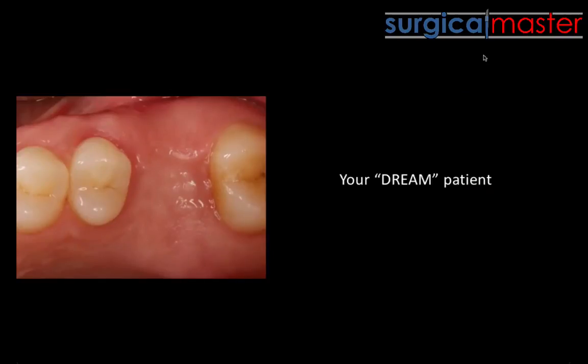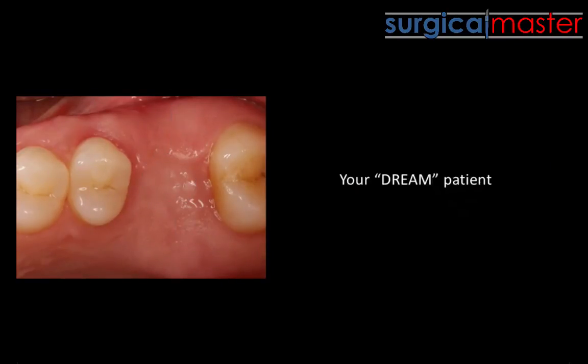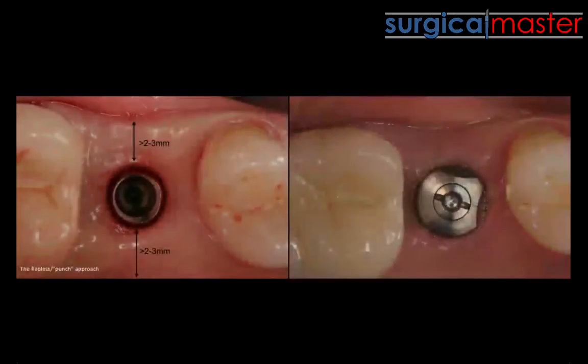We don't always have the luxury of having our dream patient. This patient has a huge ridge, and there's no doubt that you can go with a flapless approach — I almost don't need to look at the scan, but if I do, you'd see an abundance of bone. For a more reasonable patient, if you have two to three millimeters of attached keratinized tissue, that's enough for a flapless approach.